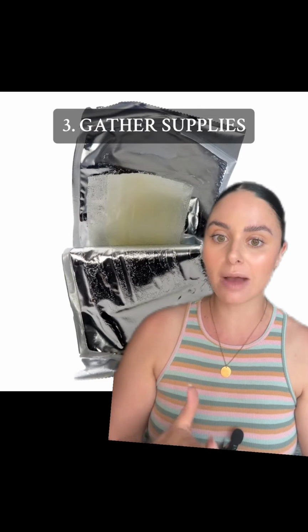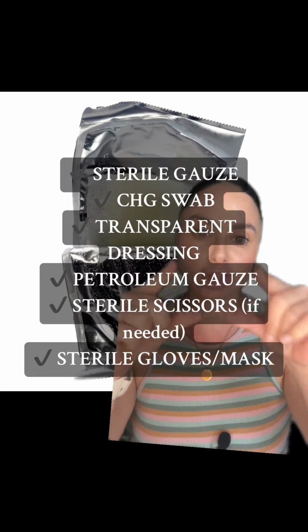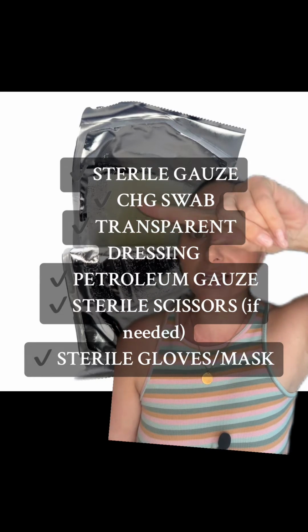The supplies I like to grab are one transparent dressing. I like to grab a couple 2x2 gauze packs. I also like to grab some petroleum gauze because this is going to really help you get that occlusive dressing once the site has stopped bleeding. I'll grab a chlorhexidine swab so I can clean the area, and if you need any sterile scissors, grab those if you're going to be cutting sutures.